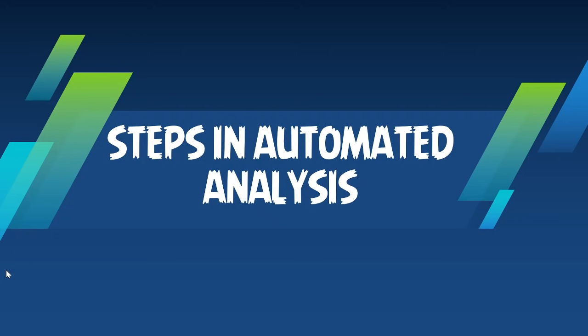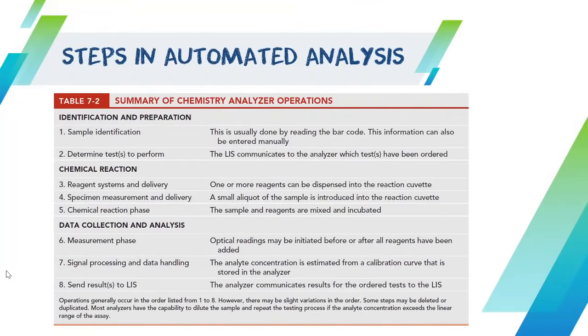So for the second part of your video lecture, this is all about the steps in your automated analysis. In terms of the different steps, we will be focusing on each phase or each step in how we analyze your different substances, from the pre-analytic phase to the analytic phase to the post-analytic phase. Each of the substeps of those phases, we will discuss in terms of what portion or what things can be automated in that part.